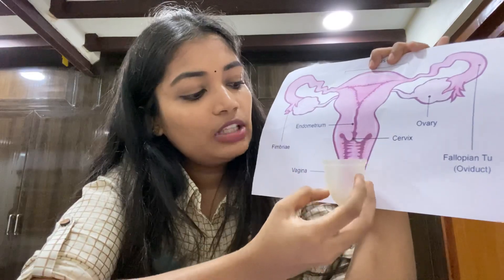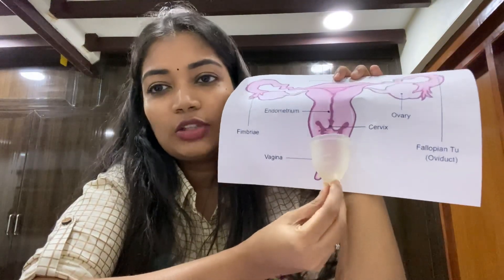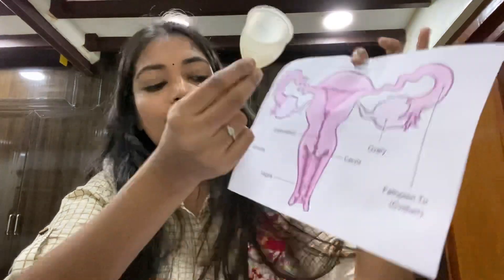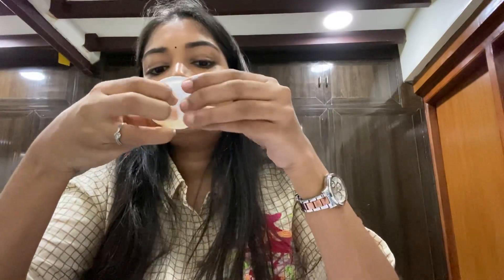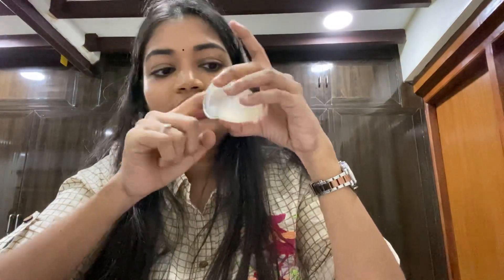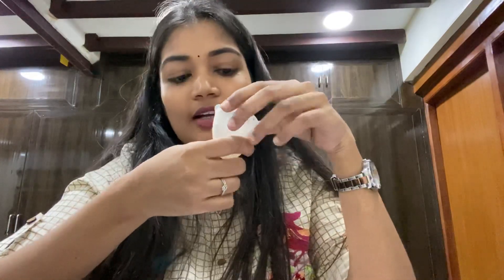If the stem is too long and causes discomfort, you can trim the stem from the bottom. If needed, you can also turn the cup inside out to reduce length. However, cutting the stem too much may cause leakage, so be careful.